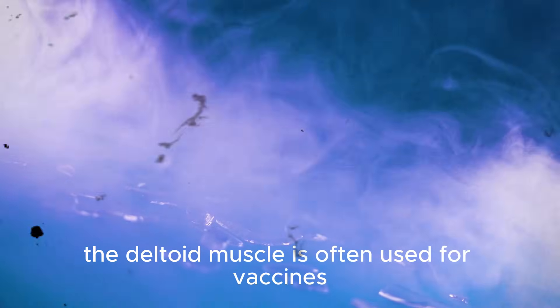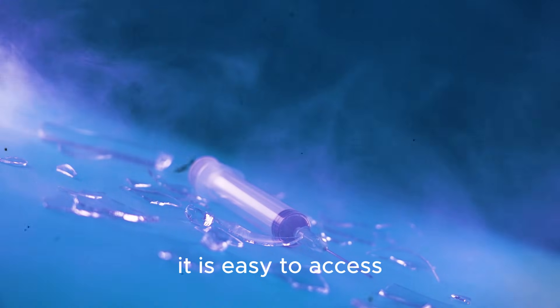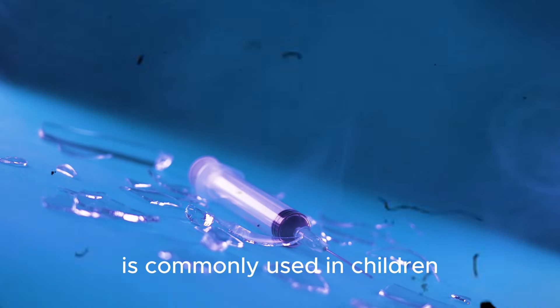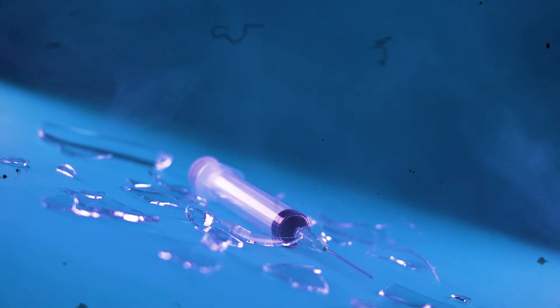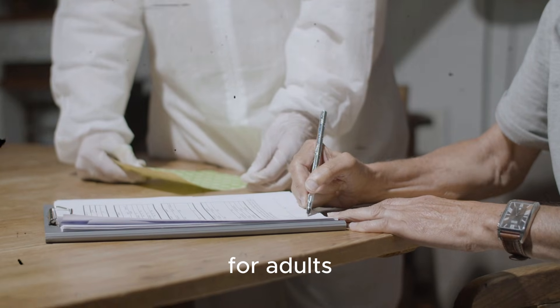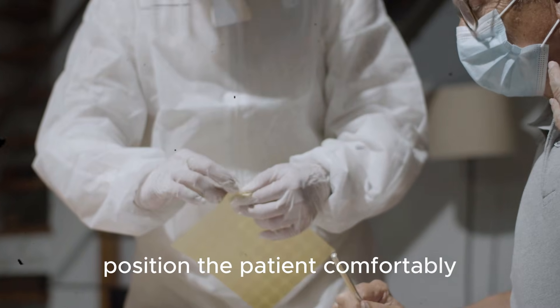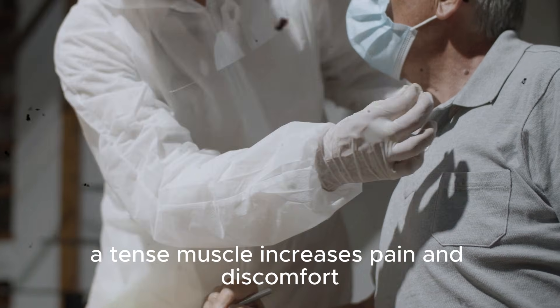The deltoid muscle is often used for vaccines and small volume injections — it is easy to access, but should not be used for large volume medicines. The vastus lateralis muscle is commonly used in children and infants because it is well developed and easy to locate. The ventrogluteal site is considered one of the safest sites for adults because it is away from major nerves and blood vessels. Once the site is chosen, position the patient comfortably; the muscle must be relaxed, as a tense muscle increases pain and discomfort.